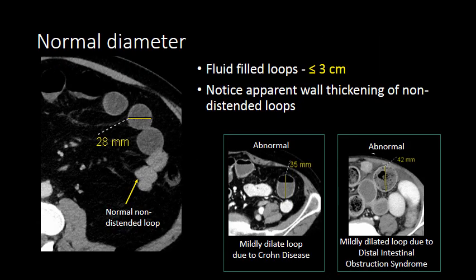When thinking about the normal diameter of the small bowel, fluid-filled small bowel loops should be 3 centimeters or less, though some people use a cutoff of 2.5 centimeters. When the bowel loops are not distended, they can appear to have wall thickening, as indicated by the yellow arrow. Here are two examples of abnormal bowel: air-fluid levels in a mildly dilated loop of jejunum related to Crohn's disease, and a patient with cystic fibrosis with distal intestinal obstruction syndrome showing a dilated loop of jejunum with pseudofeces.